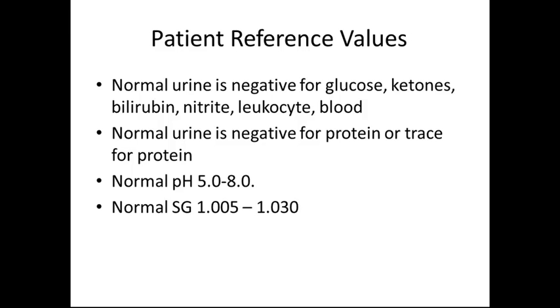And normal specific gravity is 1.005 to 1.030, so 1.005 meaning a well-hydrated patient, and 1.030 meaning a more dehydrated patient.